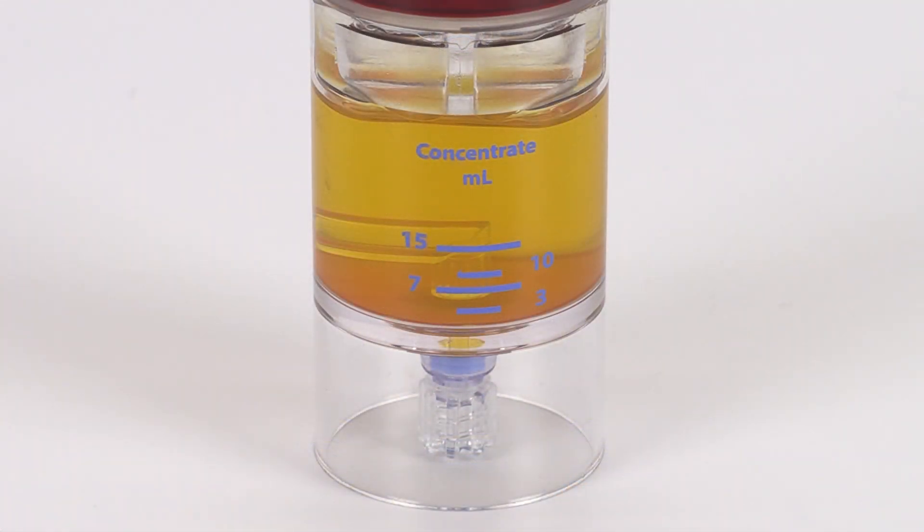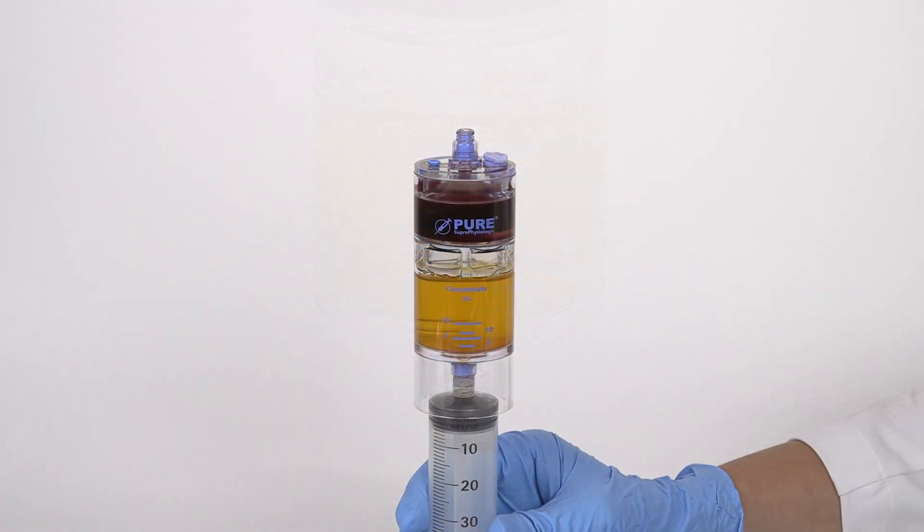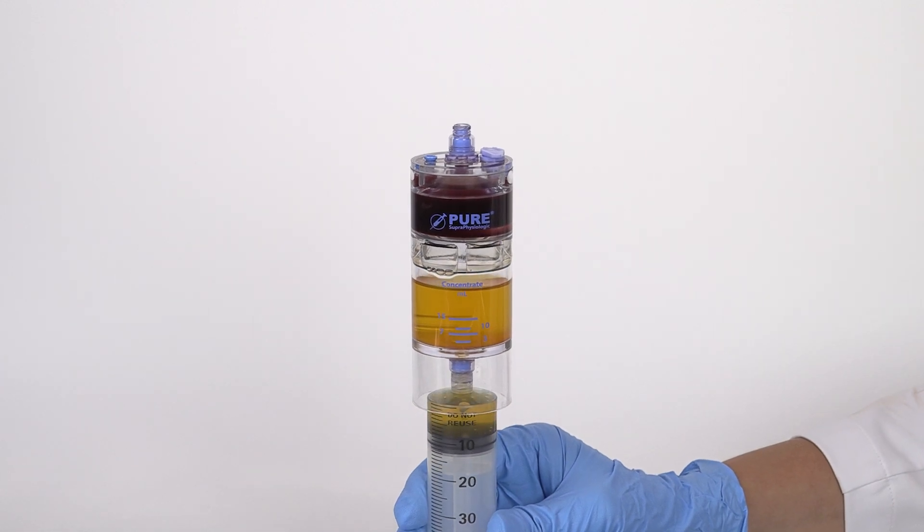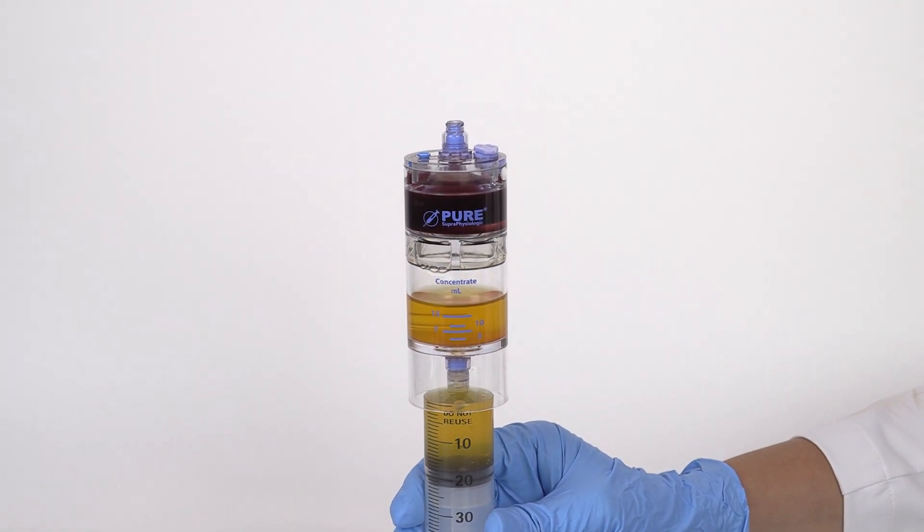After centrifugation, the supra physiologic platelet buffy coat layer will be clearly visible at the bottom of the device. Remove the clear non-vented cap from the bottom port and attach a sterile syringe.